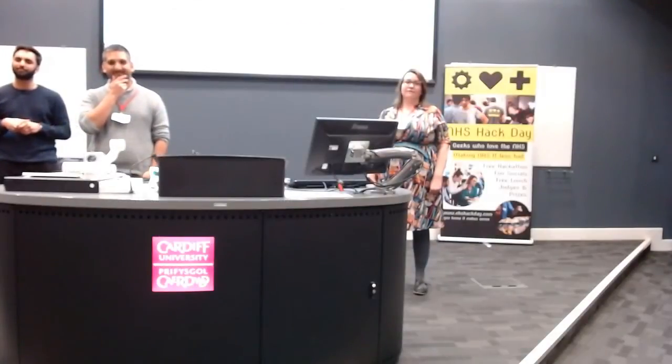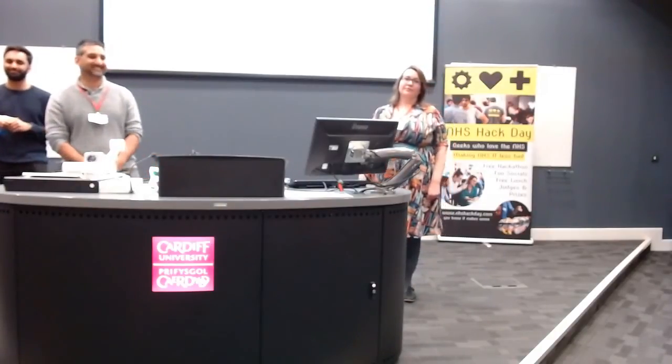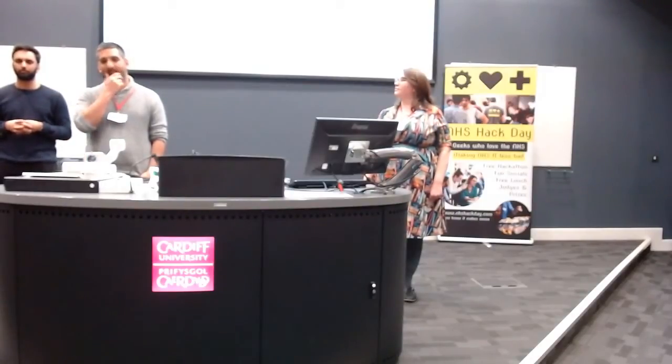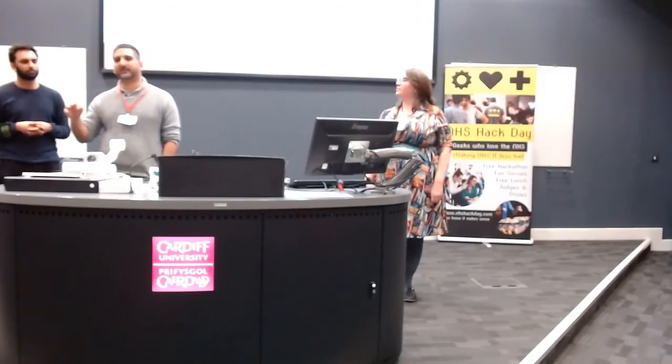I'm someone that used to have to use goniometers quite a lot, and I'm quite glad to see the back of it. But one of the things we used to find as a way of incentivising patients is to link it to what it would mean functionally, particularly with lower limb work. So once you're able to bend or extend to a certain amount, it allows you to do X, Y, and Z. Absolutely, and that's always the end goal of rehab, to make it functional, and that's something we can explore. I think in the initial injury stage, this is very useful just to get that range of motion, and then you can progress it beyond that.